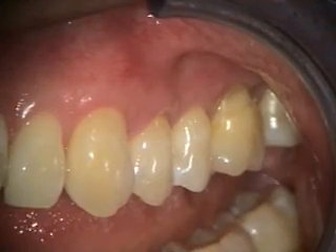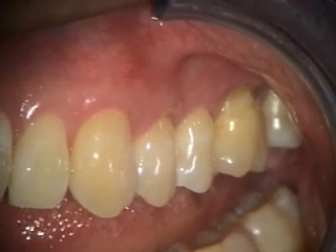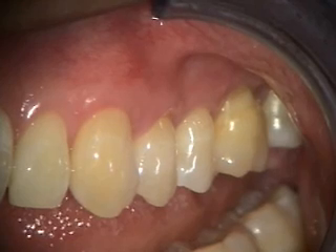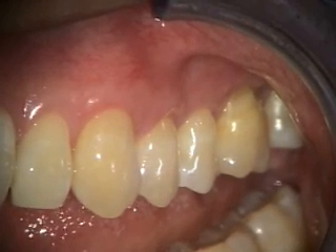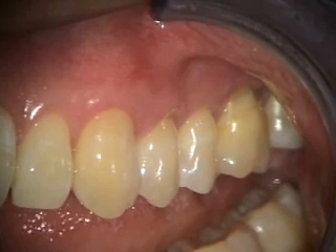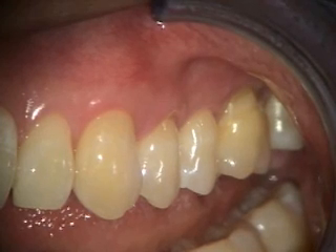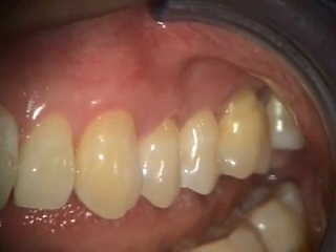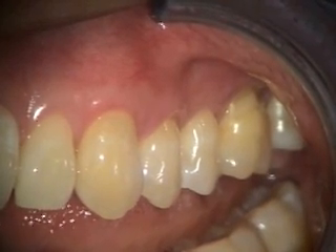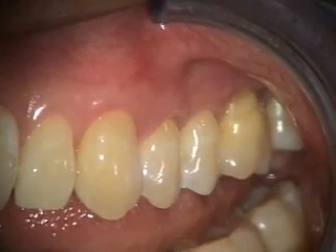This is the six-month healing of the alloderm grafting we did in the 11-14 area. Number 14 still has some recession, but we've covered maybe half of that. Number 11 got all covered, as did 12 and 13 — though 12 has just a little bit of recession on the distal facial aspect. We've got thicker tissue and it appears to be pretty stable at this point.